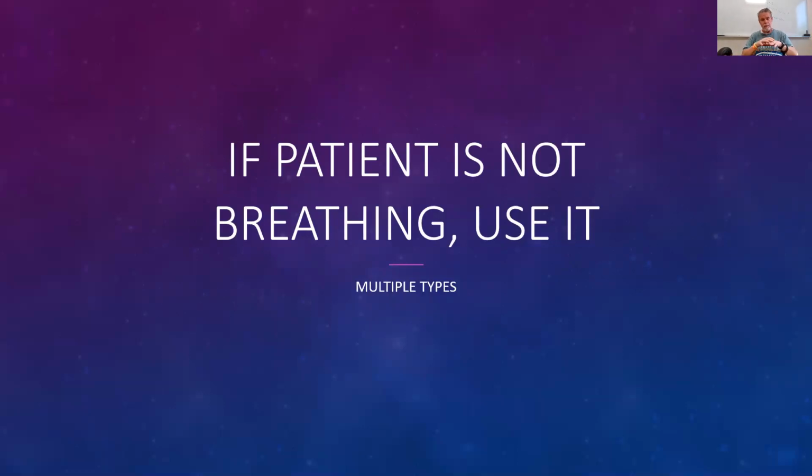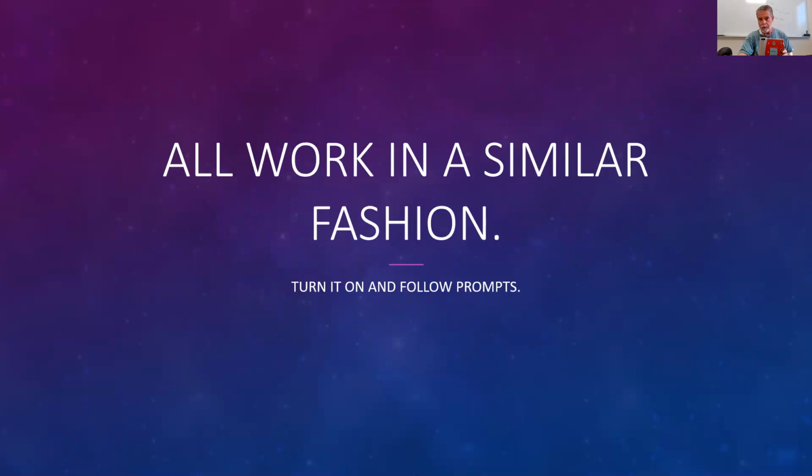And if that person is down, you can start compressions right away. And then once this device arrives, this is what you want to use. This thing takes priority. We'll look at these, and they all work in a similar fashion. And I will tell you, the first thing we have to do is turn it on. Turn it on and follow prompts.